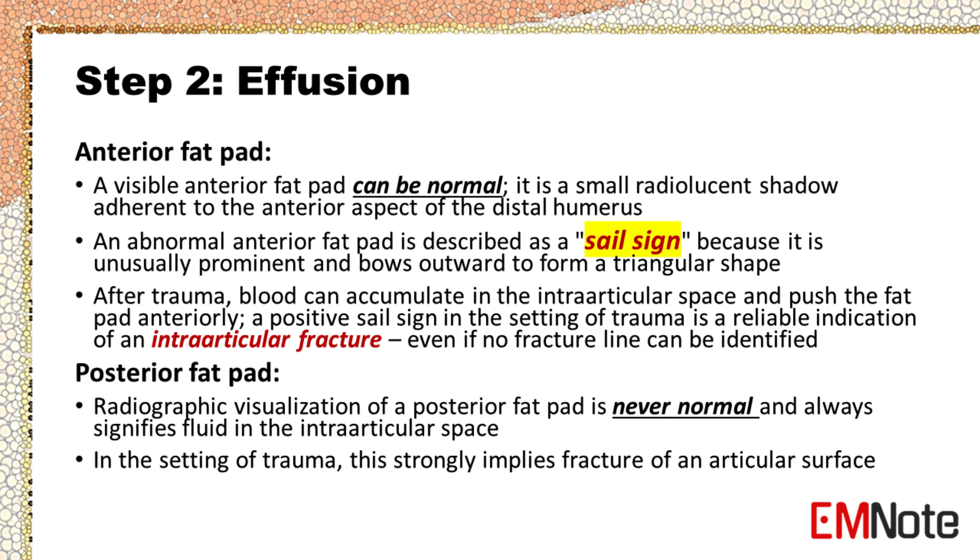Step 2 — Effusion. Check for raised fat pads. A visible anterior fat pad can be normal — it is a small radiolucent shadow adherent to the anterior aspect of the distal humerus. An abnormal anterior fat pad is described as a sail sign because it is unusually prominent and bows outward to form a triangular shape. After trauma, blood can accumulate in the intraarticular space and push the fat pad anteriorly. A positive sail sign in the setting of trauma is a reliable indication of an intraarticular fracture, even if no fracture line can be identified.